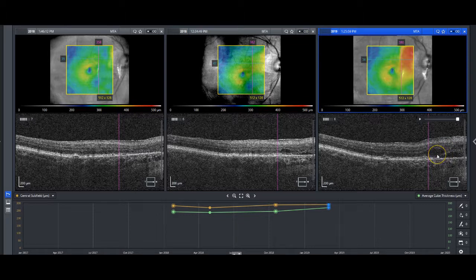So this is an area where there's increased activity of the peripapillary choroidal neovascularization, and we went on to have a discussion about treatment. Ultimately, we deferred it on this day, but if things continue in this manner, this patient will end up being injected very soon.